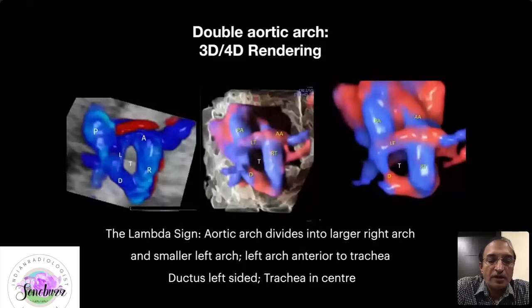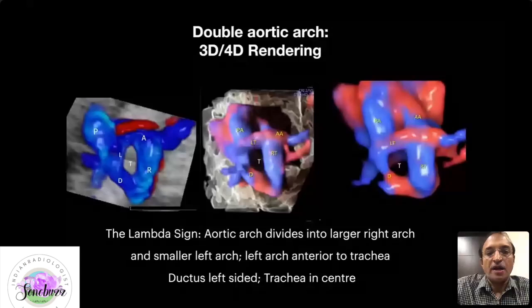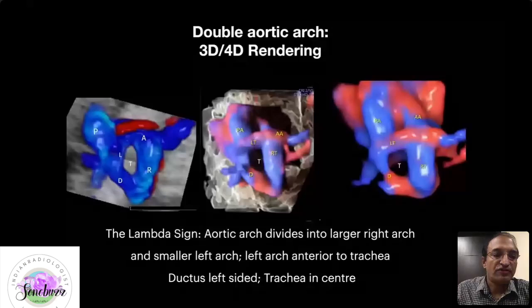This is a complete vascular ring with the trachea in the center, and it typically causes tracheal compression — so this baby is likely to be born with stridor. The distinguishing feature between the right arch and the double arch is that in the double arch the ascending aorta divides into a smaller left arch and a larger right arch, while in simple right arch the ascending aorta just continues on the right side with no bifurcation. This is a situation where 3D/4D rendering is really helpful and sometimes gives confirmatory pictures.